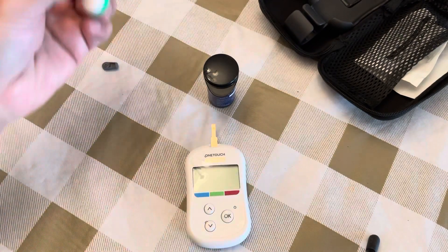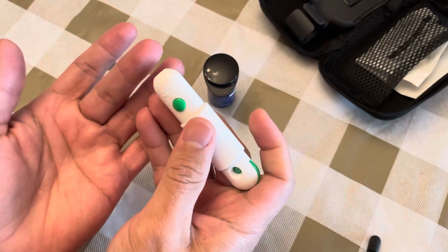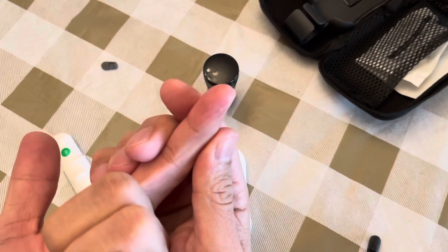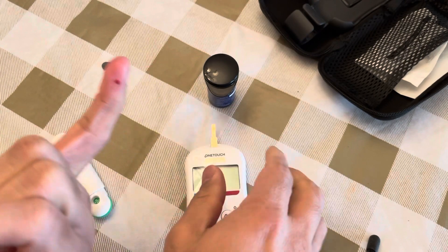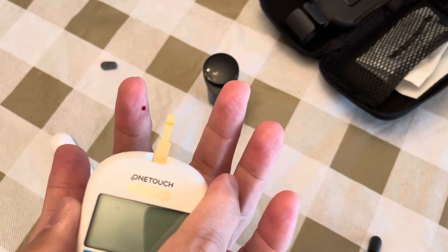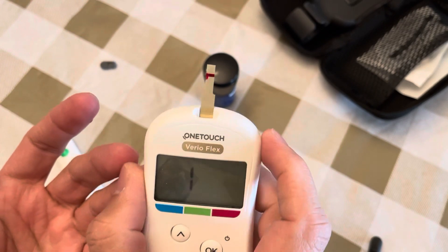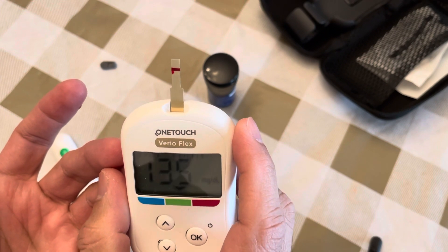Now it's time to pinch your finger — you can use any finger. Press the lancing device against your finger to puncture it. You may not see it, so massage your finger to get the blood out. Once the blood appears, touch the edge of the strip to it and it will fill automatically. The counter will then display your reading.